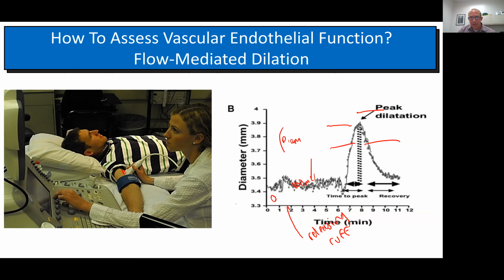Oh yeah, so here, if this is diameter, let me erase all this. So this is a measure of diameter. So the diameter is going to be pretty constant at rest. If we zoom in on it during diastole and systole, it'll go up. During systole, when the pulse is coming through, you'll see a spike, and then in diastole, the diameter will go down, but it'll be a very small change. So it'll just be kind of like this, really, all centering around the same spot usually.